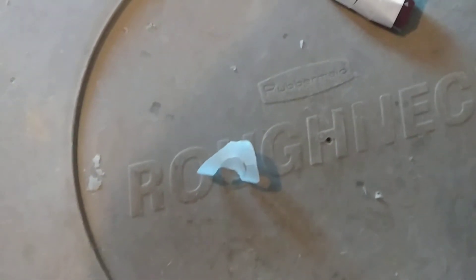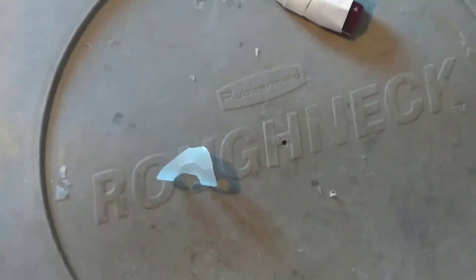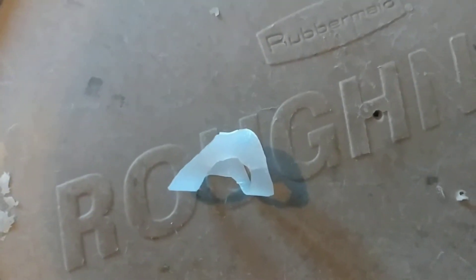Looked around online and saw lots of interesting things for these three-point things — looked a little bit like that. Oval 8 makes one, or a couple other companies, but I couldn't get anything delivered. Nothing was local in my stores — Walmart, drugstores didn't have anything, and I didn't want to wait two weeks to get one, so I made my own.